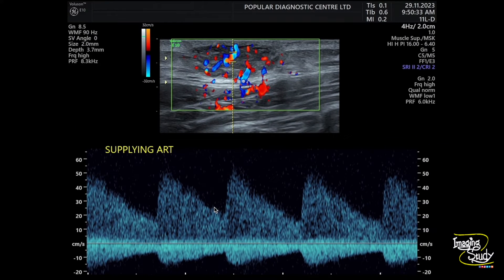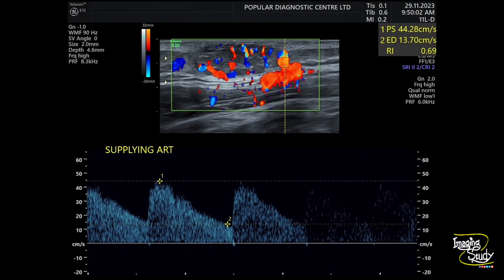We took a sample from one internal vessel, showing high velocity moderate resistant flow. We measured the resistive index — it shows around 0.69, and the peak systolic velocity is around 44 centimeters per second.